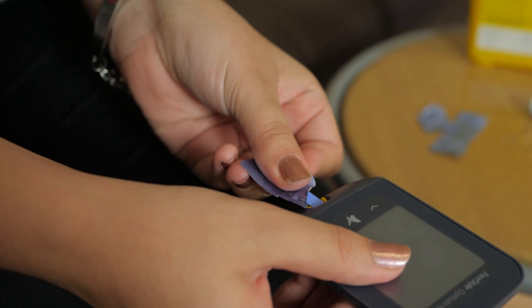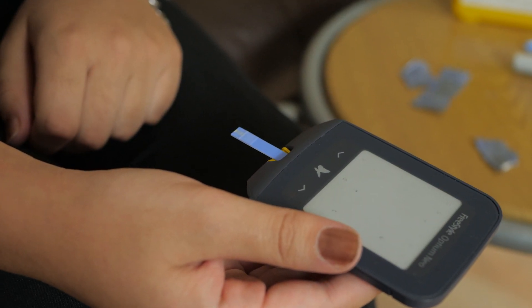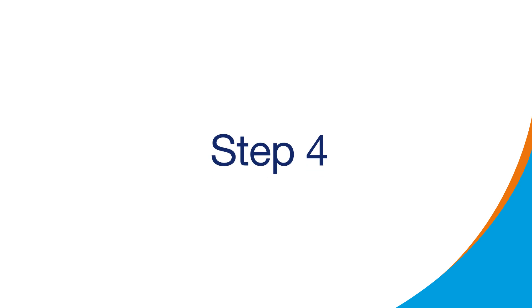Next, take your testing strip and slot it into the end of the meter. This should turn it on. Once your meter is ready, it's time to prepare your lancing device. Each one works a little differently, but the principle remains the same.